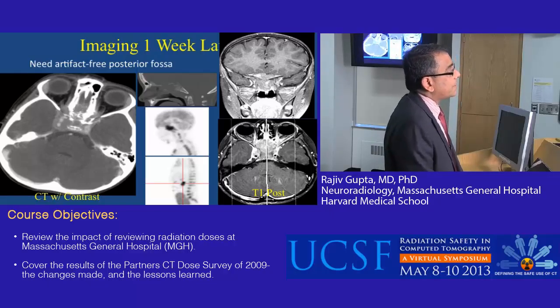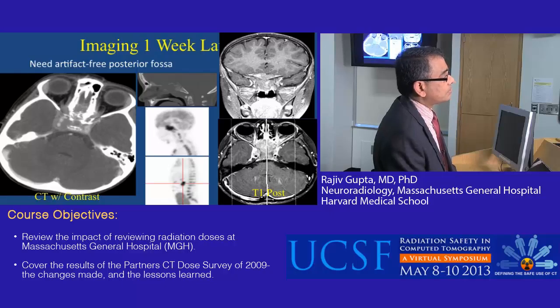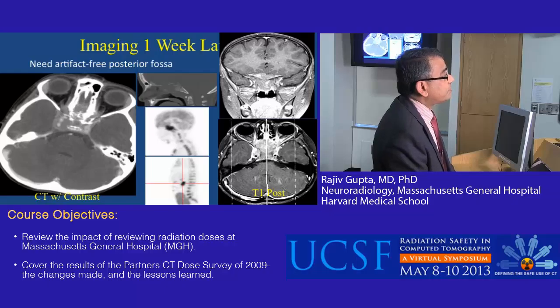In fact, the entire clivus is eroded. The tumor is visible on nuclear medicine scans, and it's also visible, enhancing, on these post-contrast T1 weighted images. So again, we need an artifact-free posterior fossa.